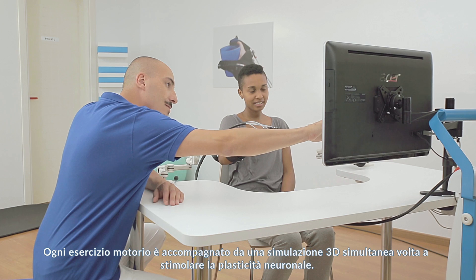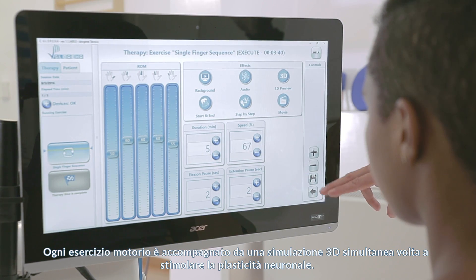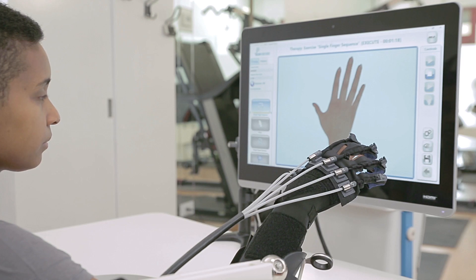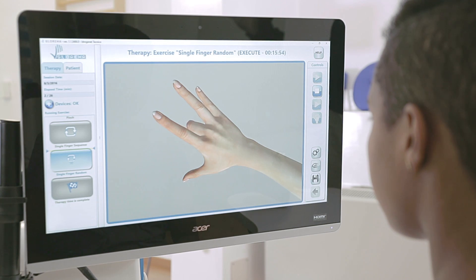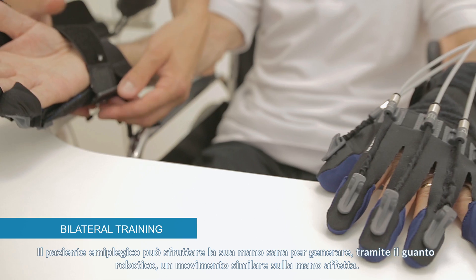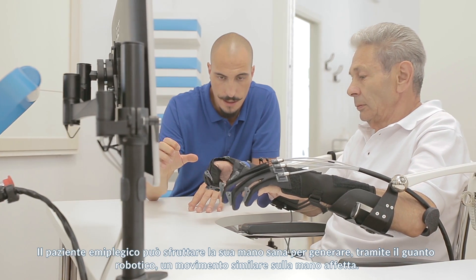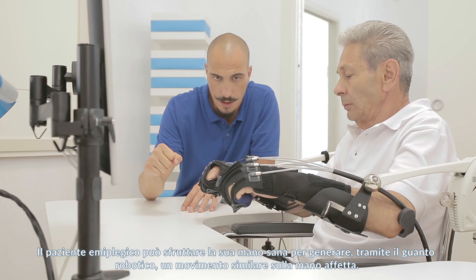Every motor exercise is accompanied with a 3D simulation to trigger neuroplasticity. Thanks to the Glorea robotic glove, hemiplegic patients can use their own healthy hand to repeat a similar movement on the affected hand.